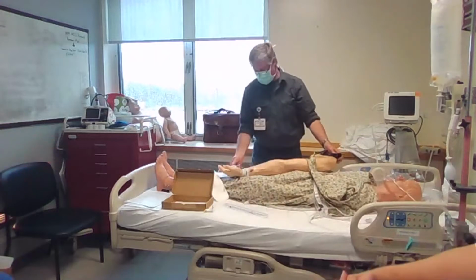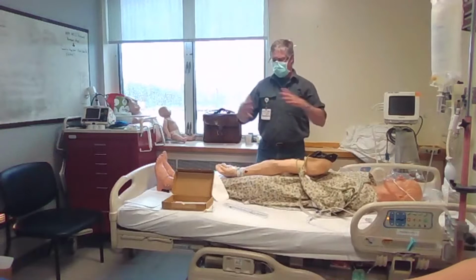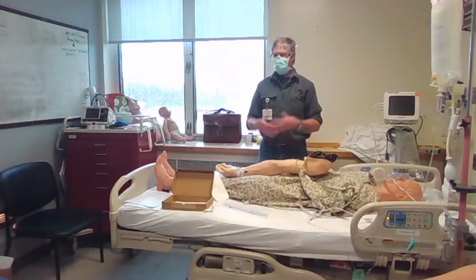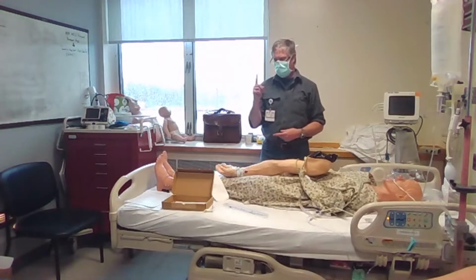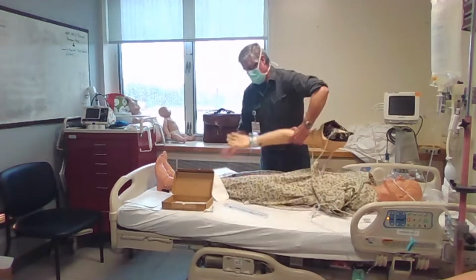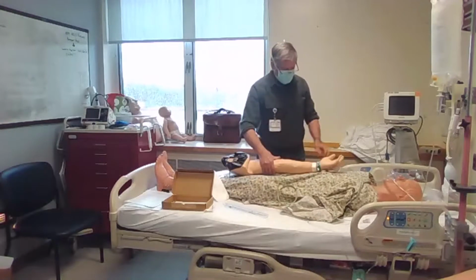Okay, so one of the things that we were always taught was that we wanted to approach the patient for a procedure in a way that you're going to succeed. Your highest chance of success is your first time. Every time after that, your chance of success actually drops by about 70%. And a lot of that is because we get a little nervous or afraid or self-critical.